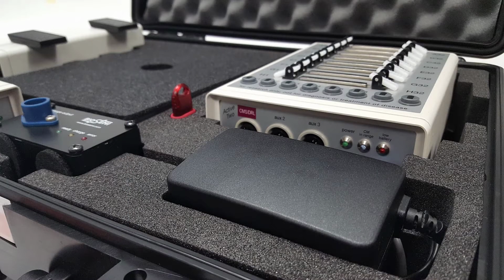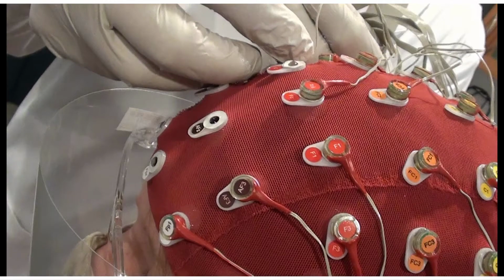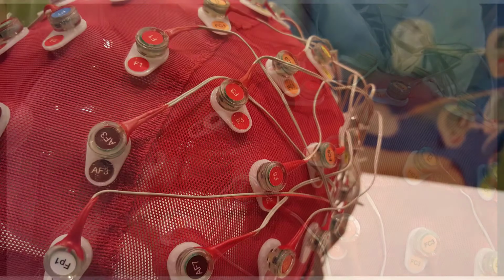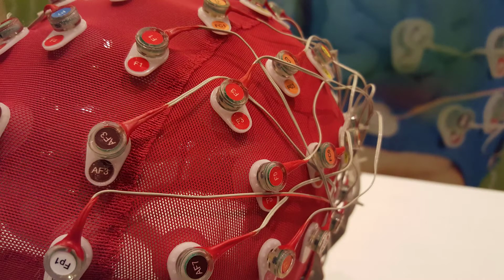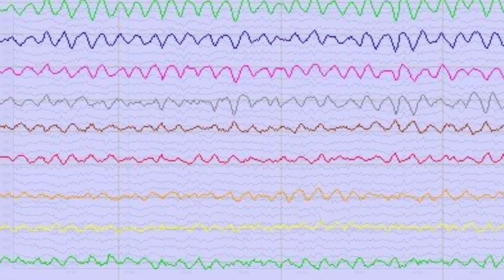Modern EEG equipment has much higher input impedance, 300 megohm in the case of Biosemi Active 2, so it is tolerant of the full range of impedances you can expect to see across unprepared skin, from about 50 to about 250 kiloohms. Any impedance reading higher than 250 kiloohms at an EEG electrode is normally expected to be a result of gel sitting on the hair rather than touching the skin.